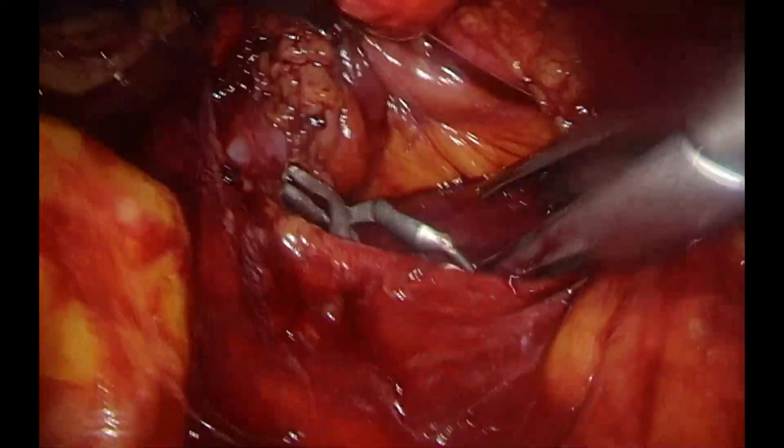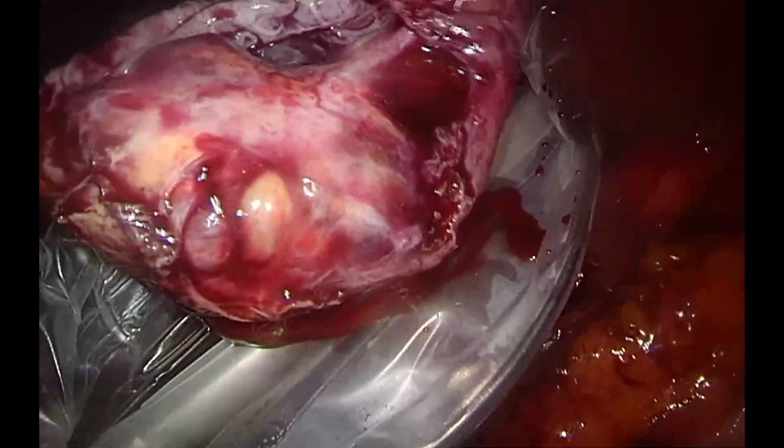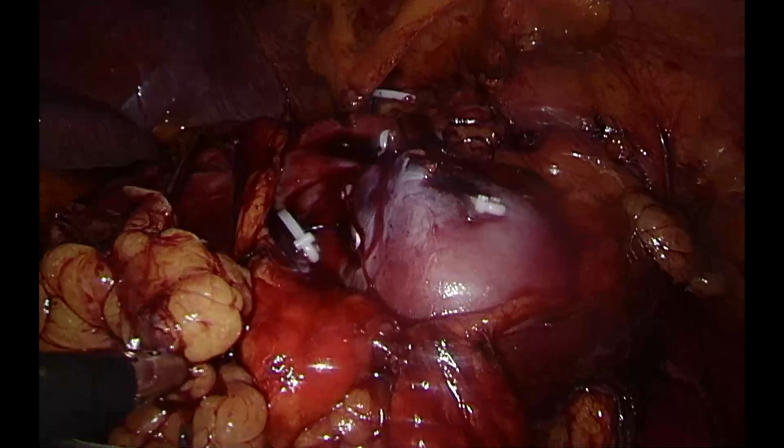The renal artery clamp was removed, and good perfusion was observed. The tumor was retrieved using an endobag. The ports were closed in layers, and the patient was extubated without complications.